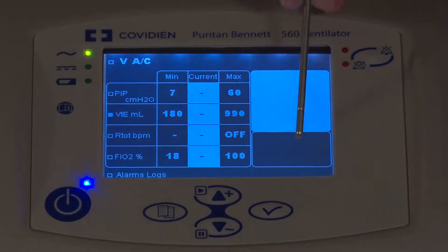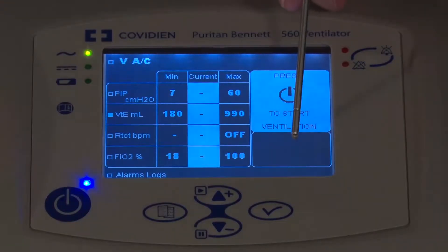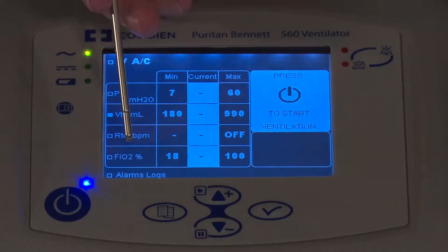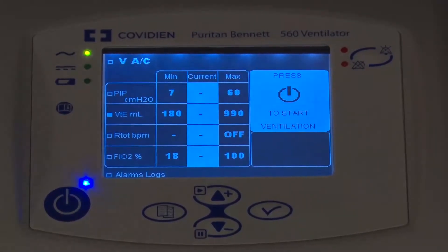If you did not pass, you would have an alarm here saying you failed the calibration. Please refer to the manual for things that you might want to check if you fail your calibration. Now that we've completed the exhalation flow calibration, we're going to move down to doing the O2 sensor calibration, which is found under the FiO2 display here.